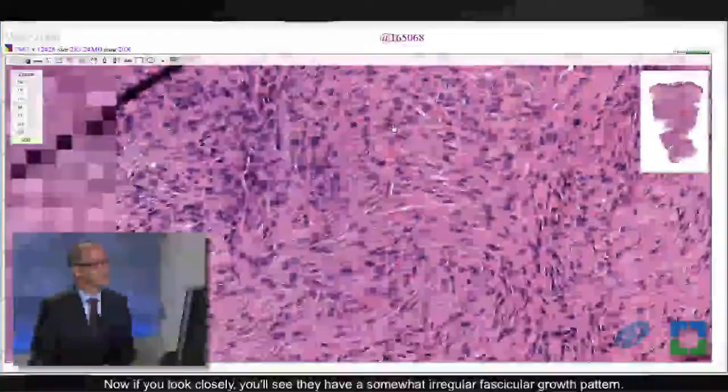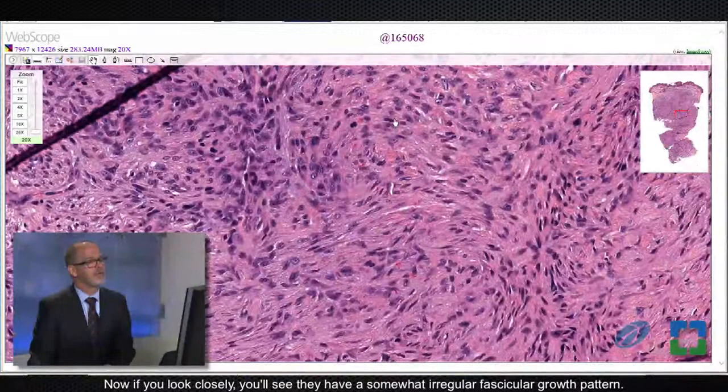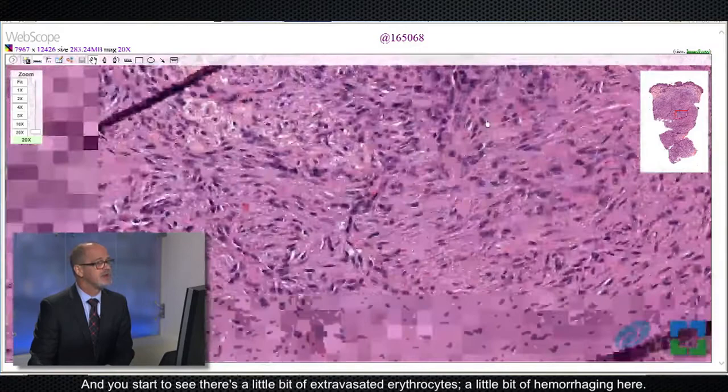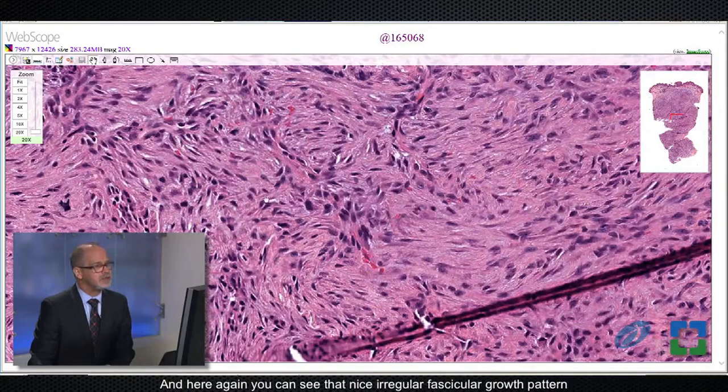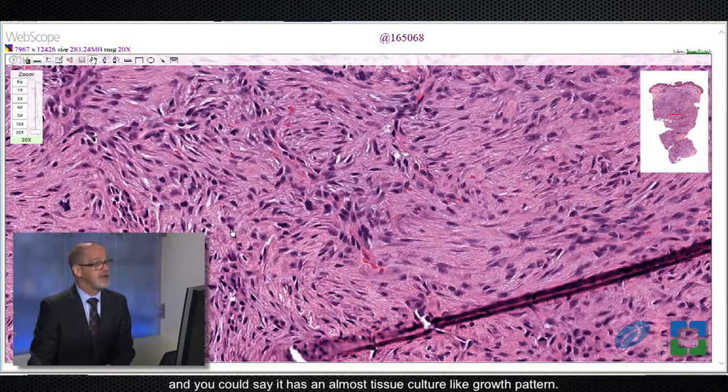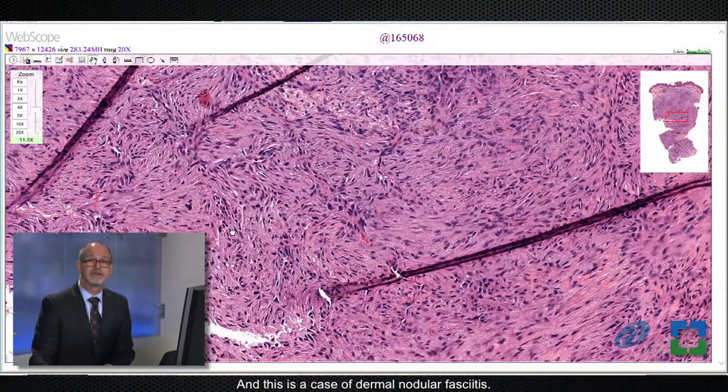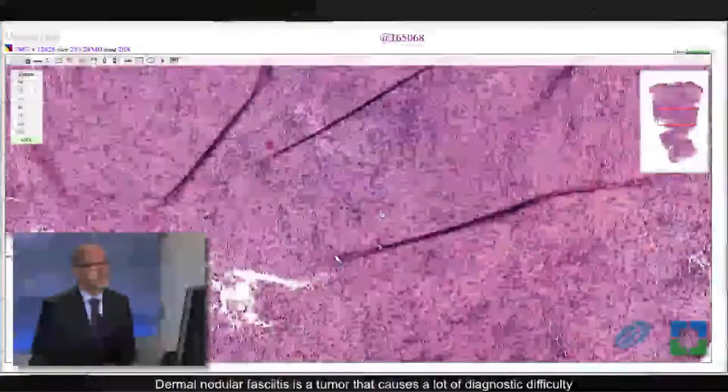If you look closely, you will see they have this somewhat irregular fascicular growth pattern. And you start to see there's a little bit of extravasated erythrocytes, a little bit of hemorrhage in here, and just very focally where the tumor cells are starting to fall apart a little bit. Here again, you can see that nice irregular fascicular growth pattern, and you could say it has almost a tissue culture-like growth pattern. This is a case of dermal nodular fasciitis.